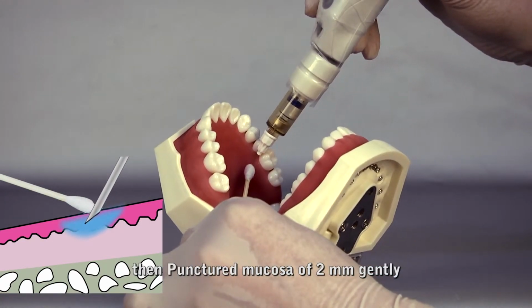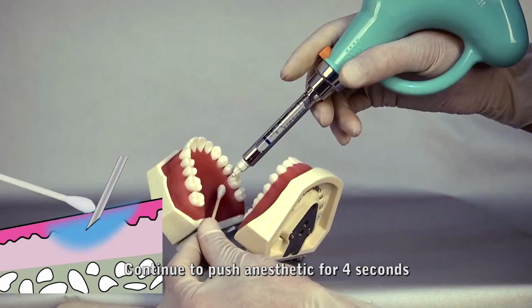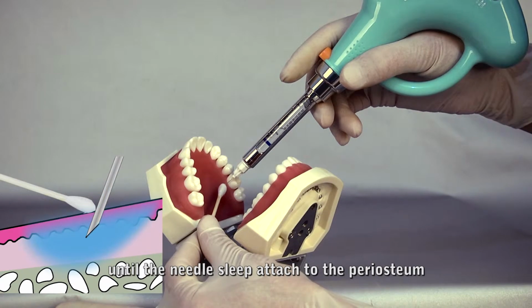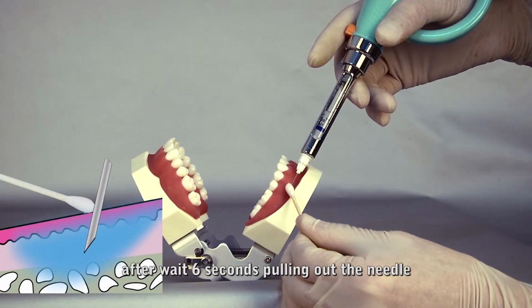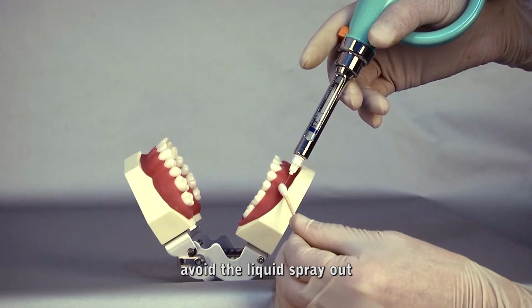Then puncture the mucosa by 2 mm gently. Continue to push anesthetic for 4 seconds. The needle moves forward 1 mm and continues to push anesthetic for 4 seconds, until the needle slips attached to the periosteum. Continue to push anesthetic to the required amount. After waiting 6 seconds, pull out the needle. Avoid the liquid spraying out.